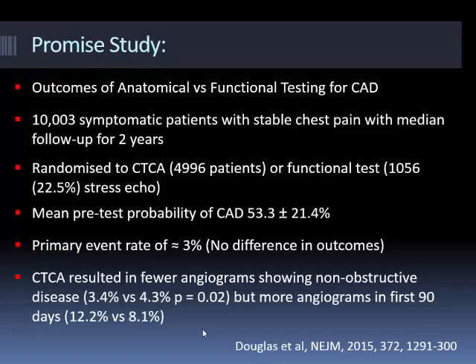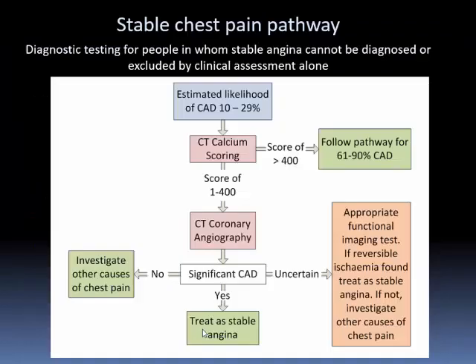So that's been helpful. But the bottom line is, if you do use CT angiography alone as opposed to physiological tests, your service is not going to be at any disadvantage compared to physiological testing. Obviously, you have to temper that with what you do with the intermediate stenoses, but that's a separate problem.